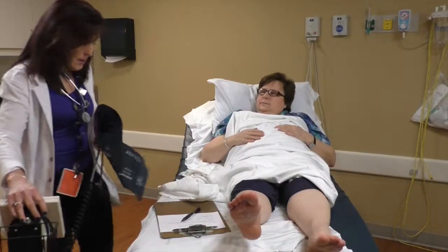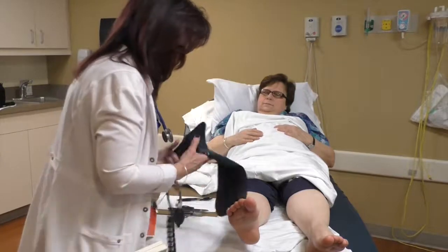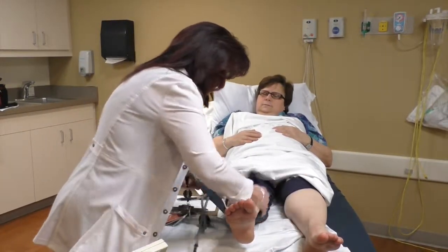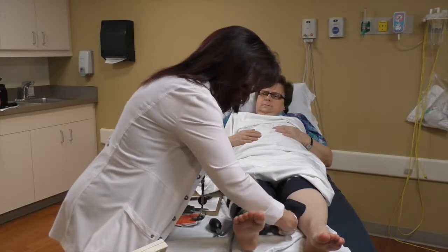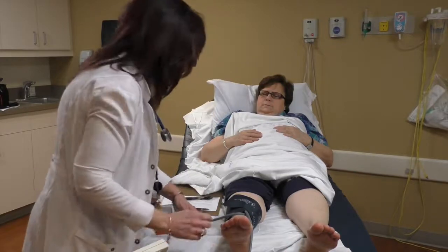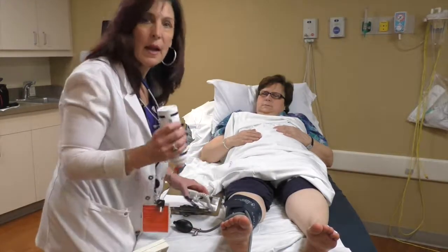Now I'm going to place the blood pressure cuff on your right ankle. We'll actually be listening to two arteries at the level of your ankle and taking both measurements. Then you will compare them to the highest blood pressure in whichever arm is the highest.